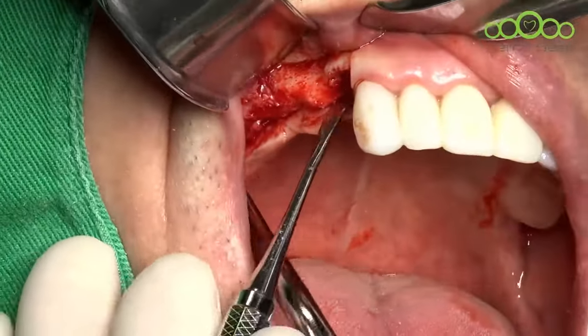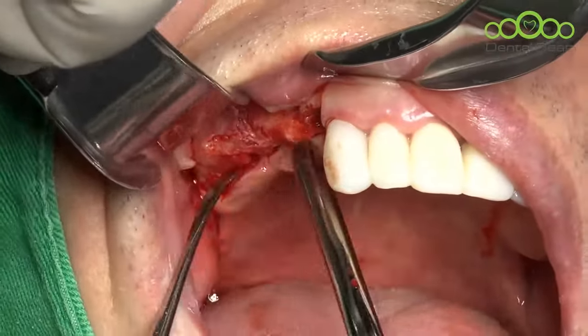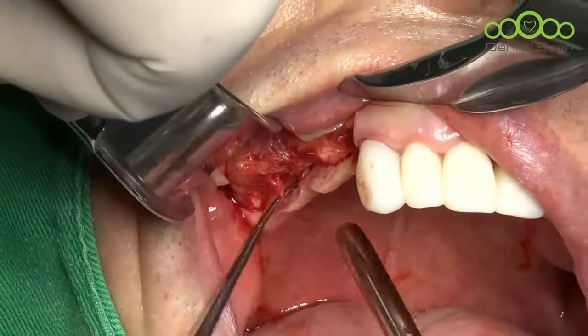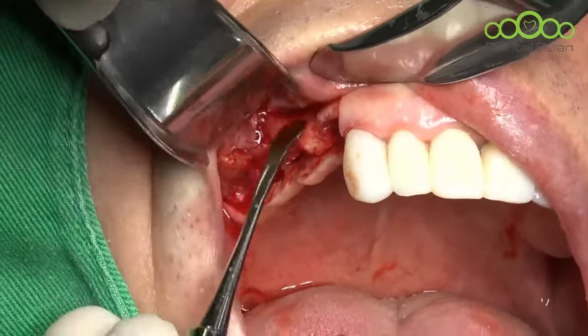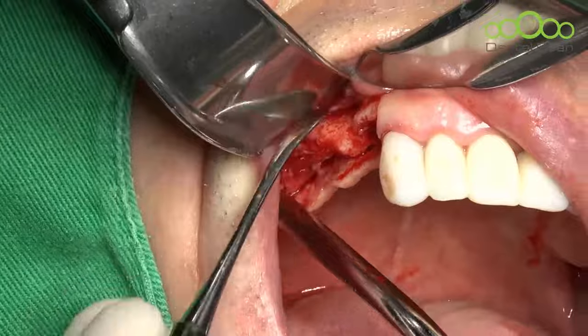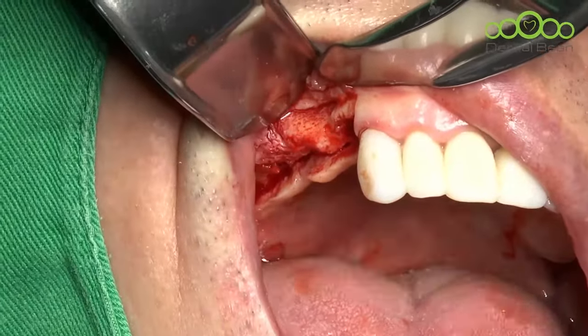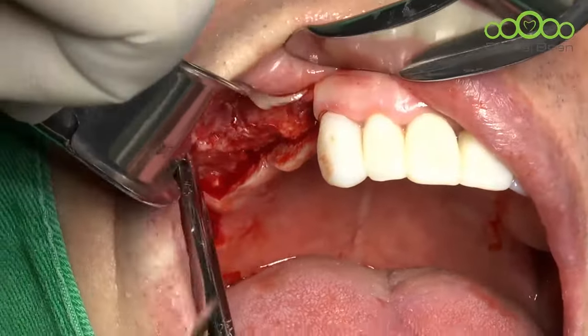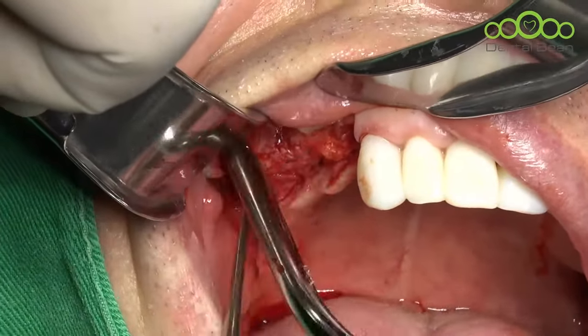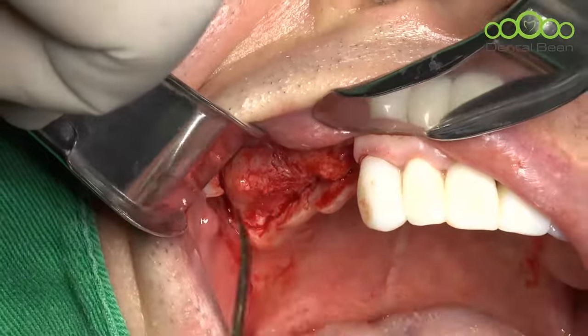The ridge looks not fully healed. It has passed more than 4 months. Okay, not bad. As you see, the premolar site looks narrowed. I have to do something here. And this side looks too bulged.